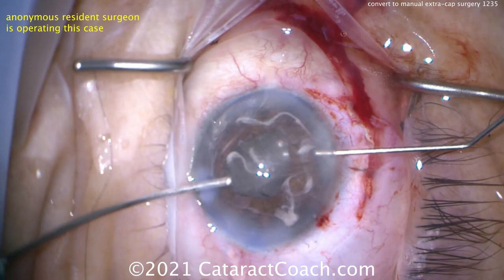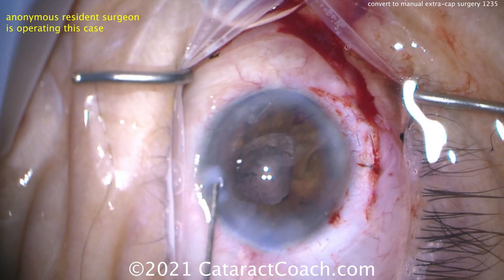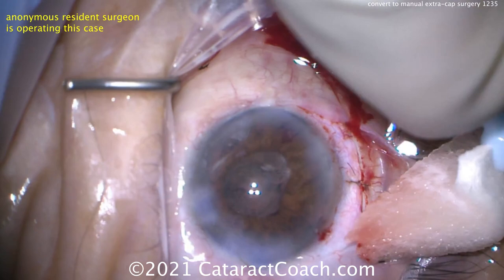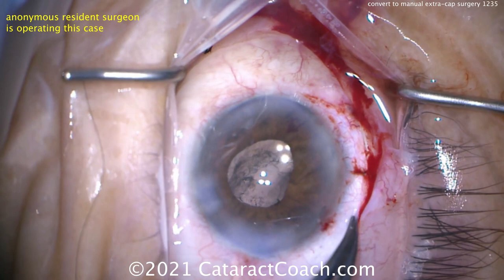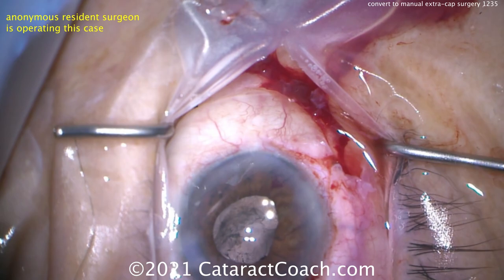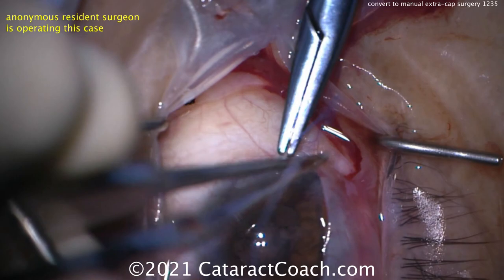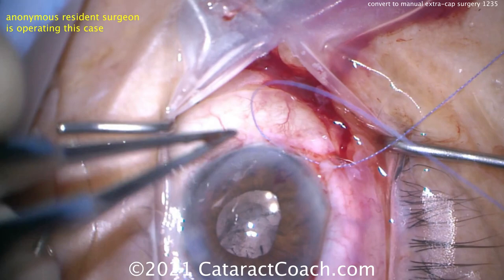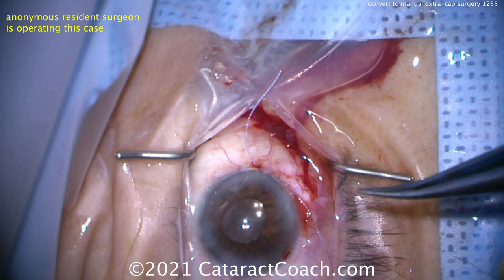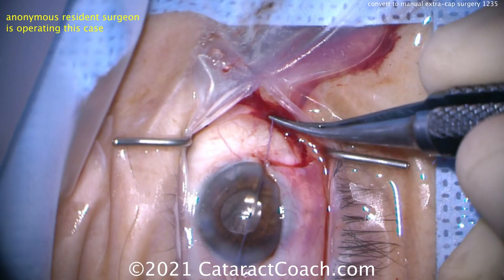Make sure you decrease the flow rate for viscoelastic removal. A last check with more triamcinolone just to be sure. That looks great. There's a little viscoelastic or slight heme on the posterior aspect of the lens — that slight opacity in the center of the optic is of no consequence and will be gone before you know it. The main incision is sealed nicely without sutures. Placing a suture to close the conjunctiva and calling this case done. The patient had a very nice outcome with no further post-op complications. There are times for every surgeon where you may have to convert FACO to a manual extracapsular cataract extraction, and you need to know how to do it on the fly.